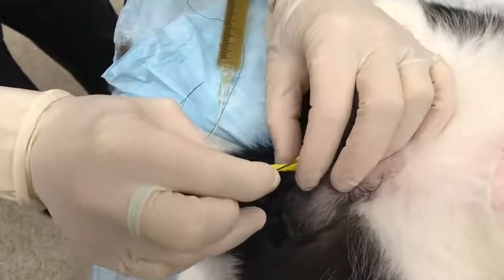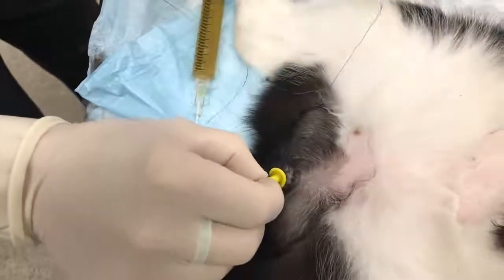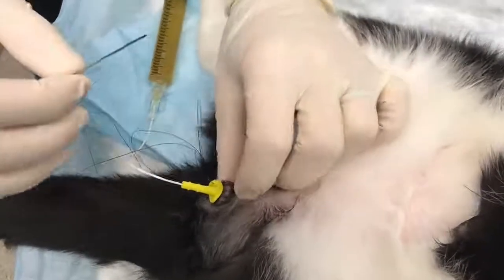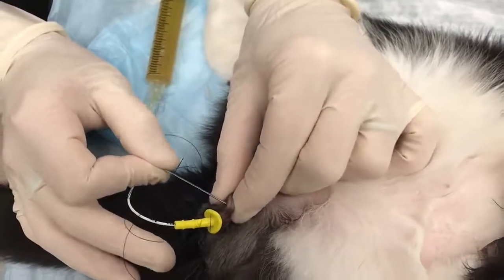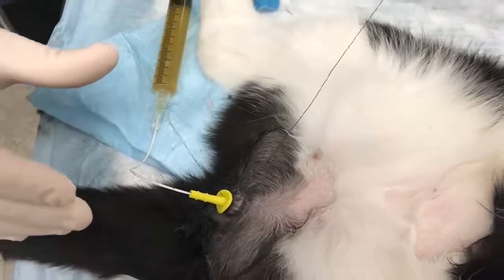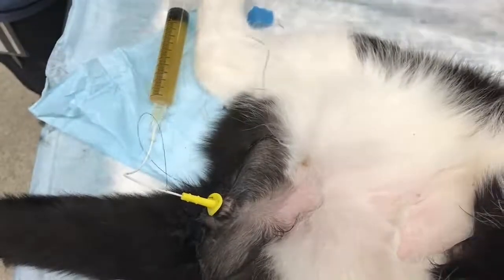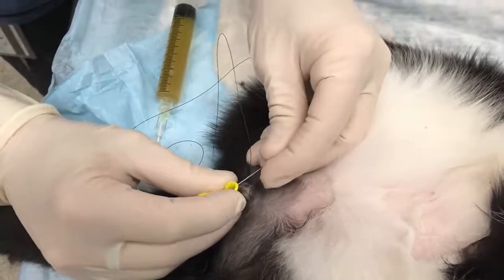Seen here is how to attach the catheter to the cat using the suture device. Using 3-0 nylon suture attached to a needle, pass the needle through one of the large holes of the base of the suturing device. Then using a horizontal mattress pattern, pass the needle through the skin of the prepuce, and then back up through one of the holes of the suture device. Tie the suture at this point. This process should be repeated one additional time.